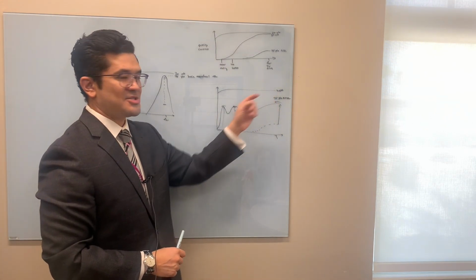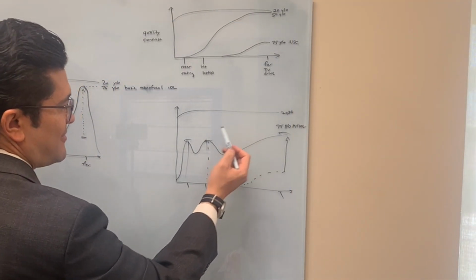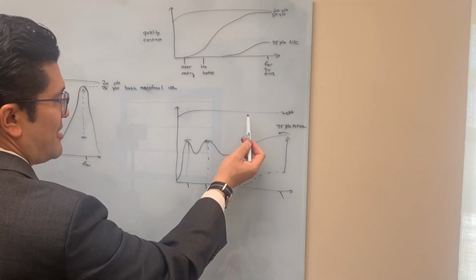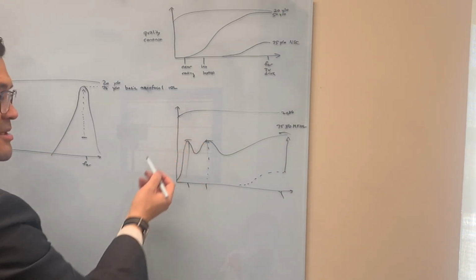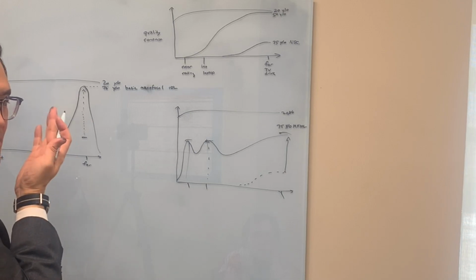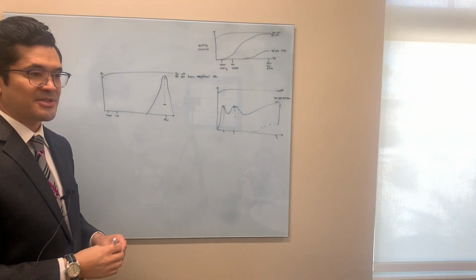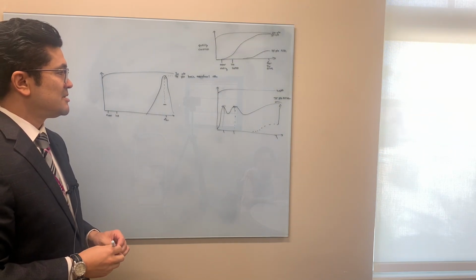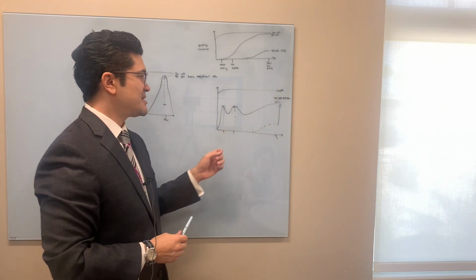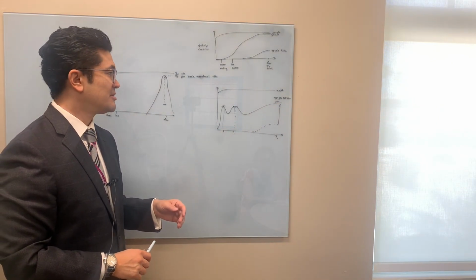Now, it probably won't be good as a 20-year-old, because a 20-year-old has this range, this kind of in between the intermediate near, and the 20-year-old can go a little bit closer too. And the 20-year-old up close can even hold the book right here and see it, but not the 75-year-old with the multifocal. So when we talk about multifocal lenses for a 75, 80-year-old, they are thrilled with it in general.